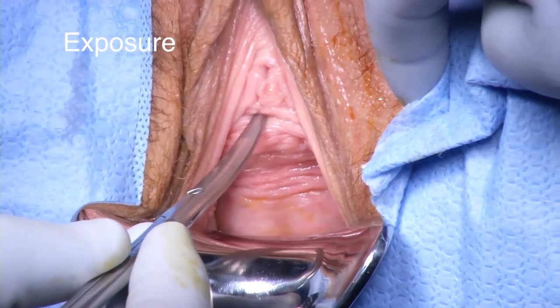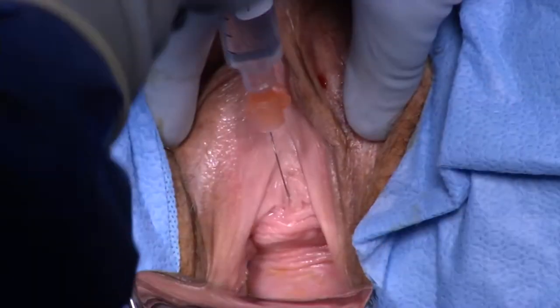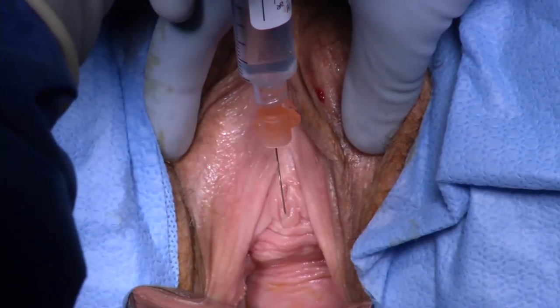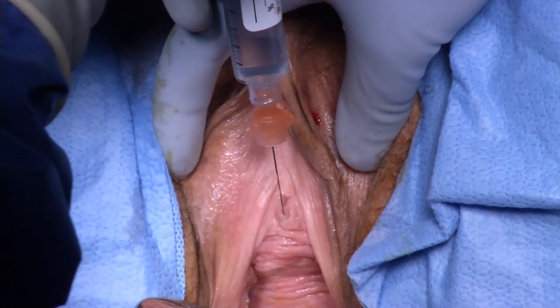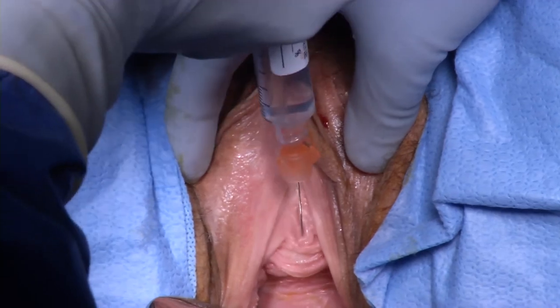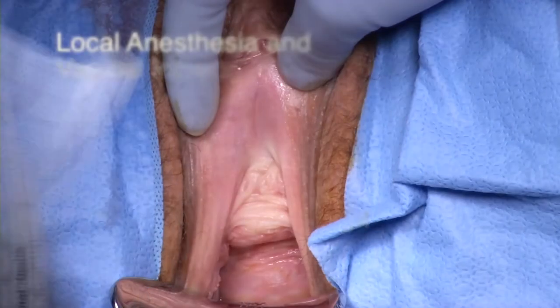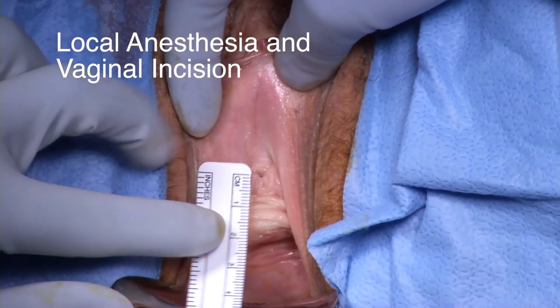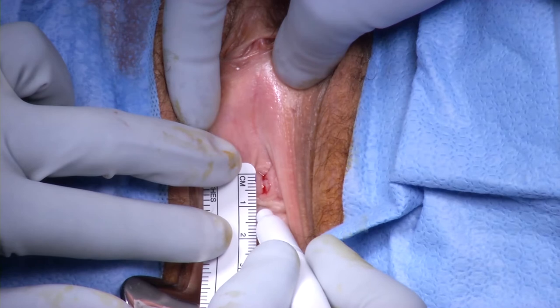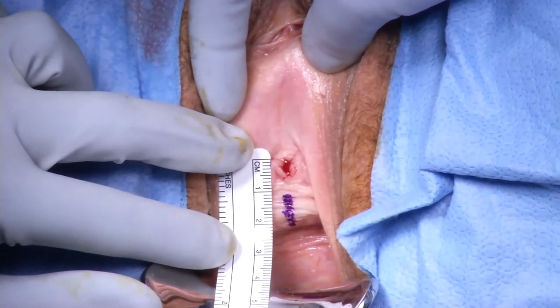The vaginal speculum is placed. Here you can see important anatomic landmarks, notably the level of the mid to distal urethra and the level of the bladder neck. 1.5% lidocaine with epinephrine is injected under the vaginal mucosa. A 1 cm long mark is made along the distal anterior vagina starting 1 to 1.5 cm from the urethral meatus in order to approximate the area of the mid to distal urethra.